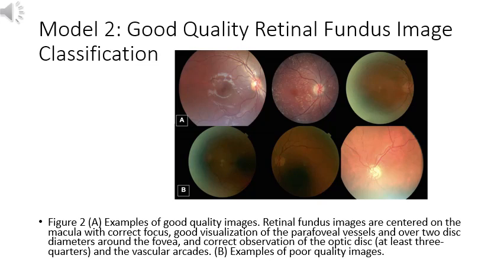Figure 2 shows an example of good and bad quality retinal fundus images. We also trained the same CNN1 from scratch for a different objective with geometric data augmentation.